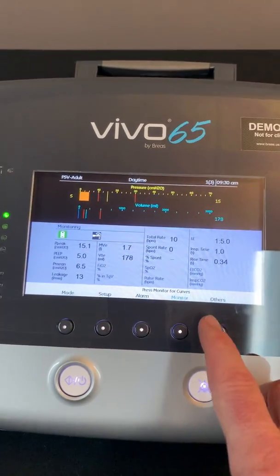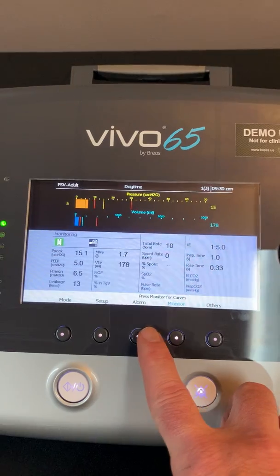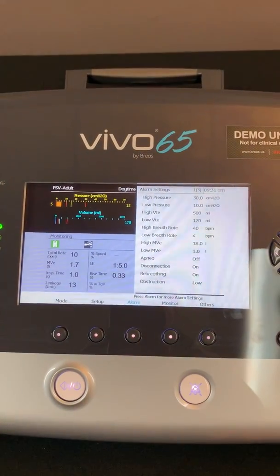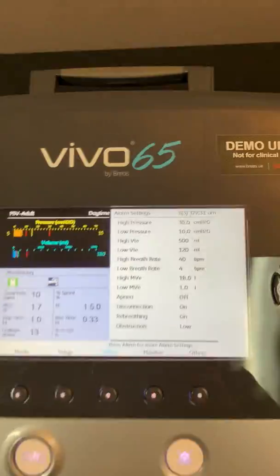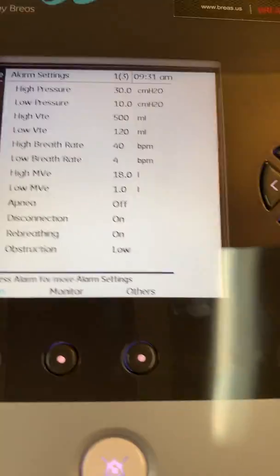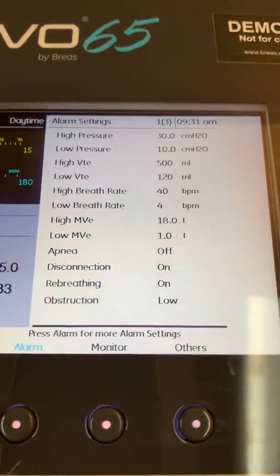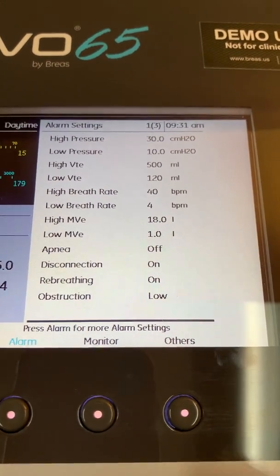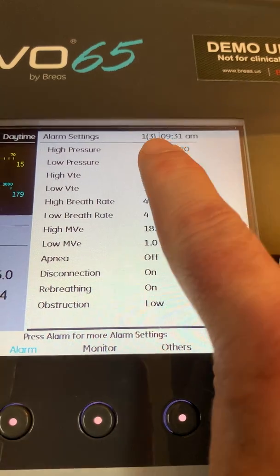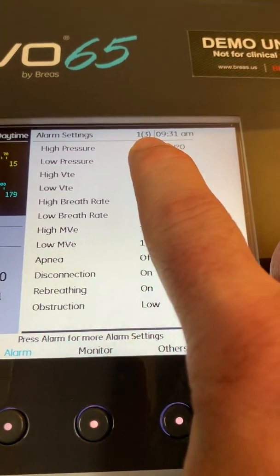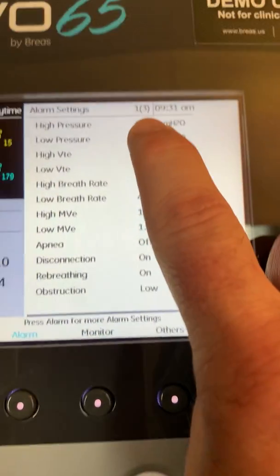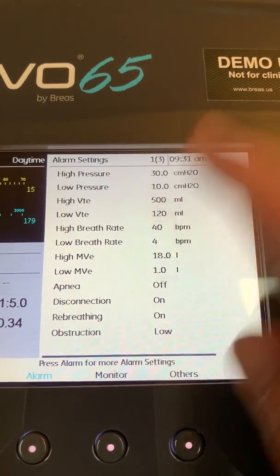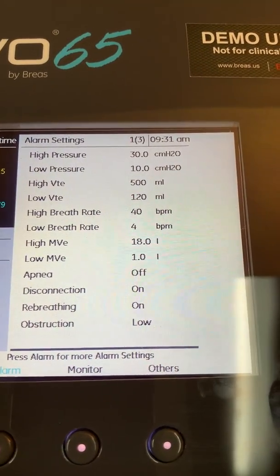Let me move a little bit closer here. To open up the alarm menu, you're just going to press the button underneath the word alarm. That opens up our alarm menu. What we're looking at here is one of the three pages of alarms. This is our main, or our first page, of our alarm settings.